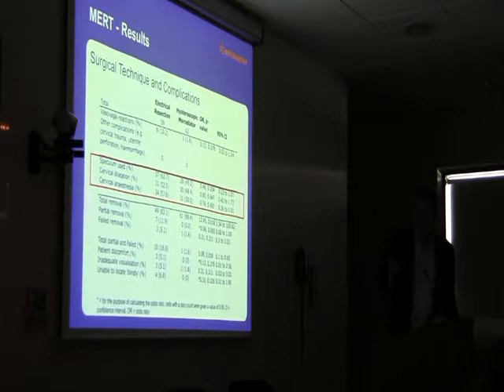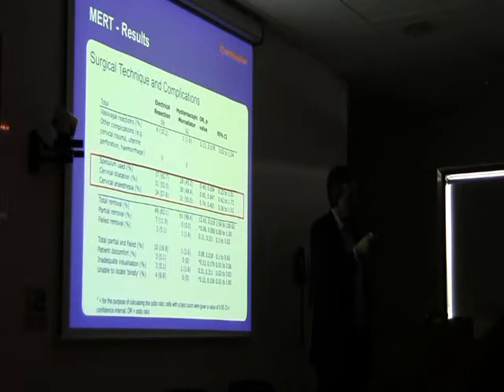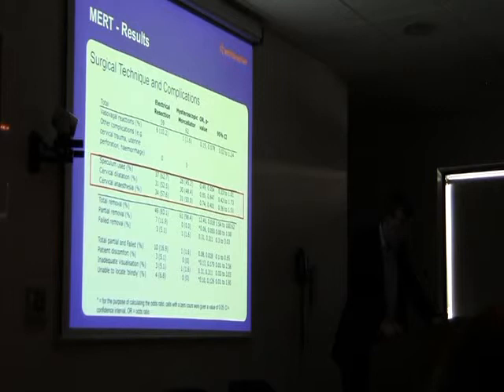But if you look here at the amount of speculum usage, it was greater in the resection group, the amount of cervical dilatation was similar, the amount of cervical anaesthesia was similar. That's because the whole problem with the VersaPoint is you can remove things beautifully, but getting the lesions out can be quite difficult, and then you have to dilate, and then eventually you might not come out in vision, and then you might have to go in blind with the instrument in the uterus. As I was saying to you, I think blind uterine instrumentation should become a thing of the past. So even though it's a slightly larger diameter, 5 millimetres, it's not been requiring any more anaesthesia.